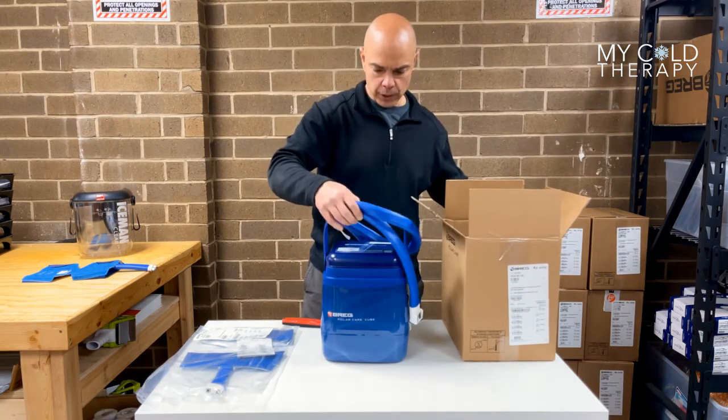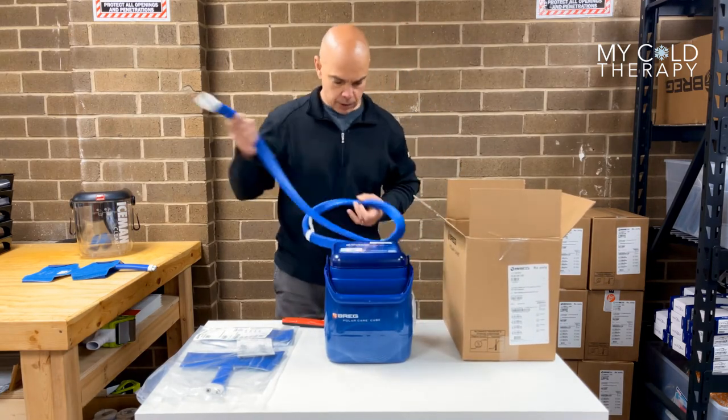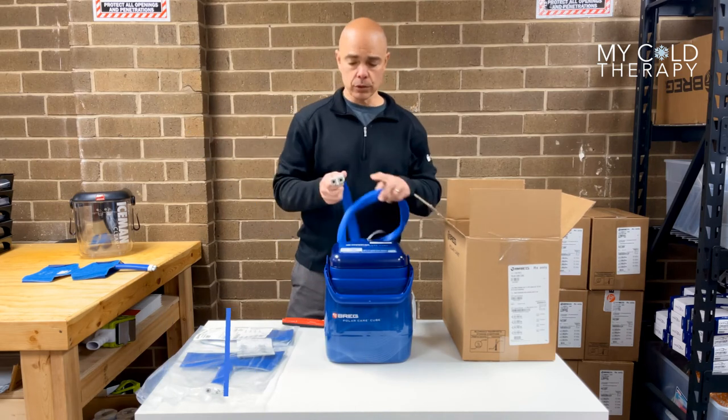This is the Breg Polacare Cube — this is what it looks like. It's going to come with a hose and two connectors.